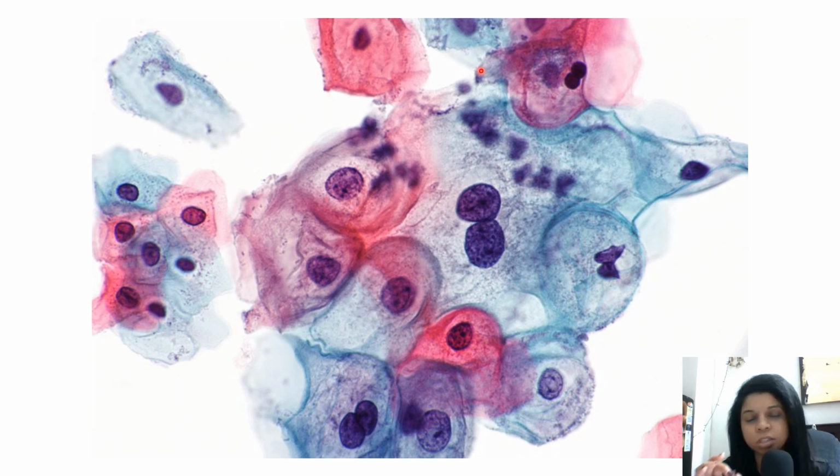For greenish discharge and whitish discharge, the clinician will already know trichomonas and curdy discharges, candidiasis, and they might have started treatment even before we give the diagnosis. So we can support them in that way, but even if the patient is coming for infection or any other thing, it's very important that you screen the slide fully for squamous intraepithelial lesion or carcinoma.